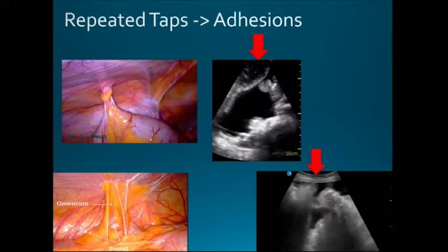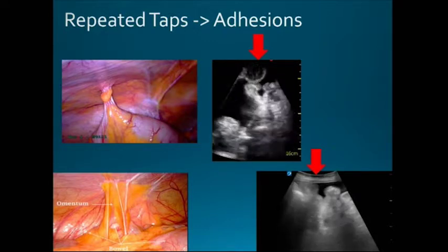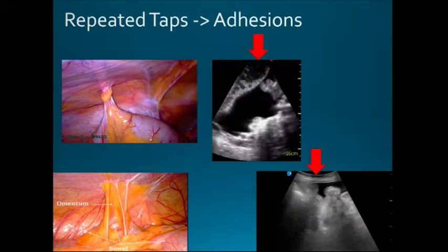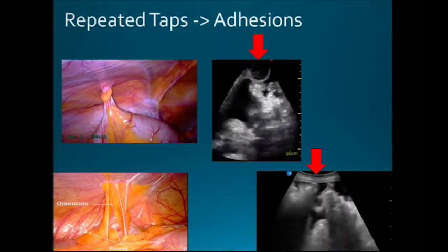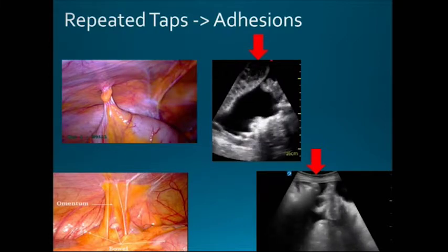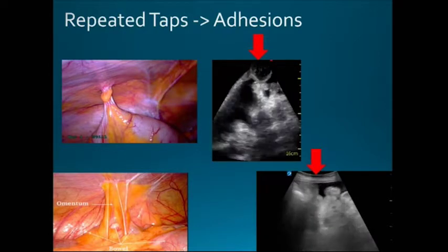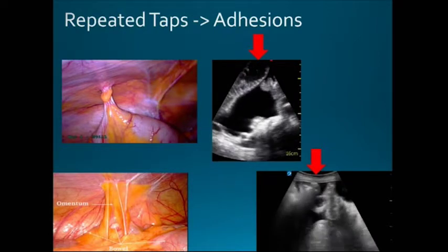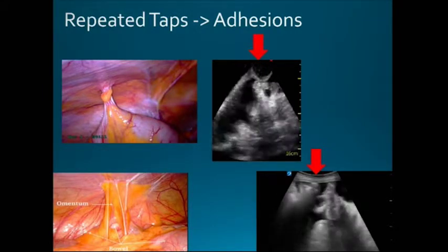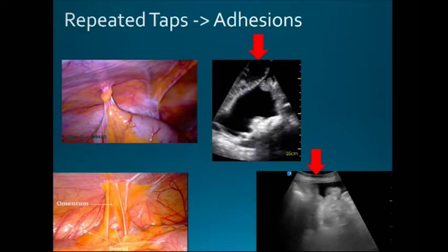Now, the top of the screen on the ultrasound is always going to correspond with what's close to the probe, right? And so this is right where the path of the needle would go, and you can see that right in front of that needle path here, this is a loop of bowel, and you can see the little villi in here. You can see the loop of bowel just tacked up against the abdominal wall. And so this is an example of a clear-cut sort of save.